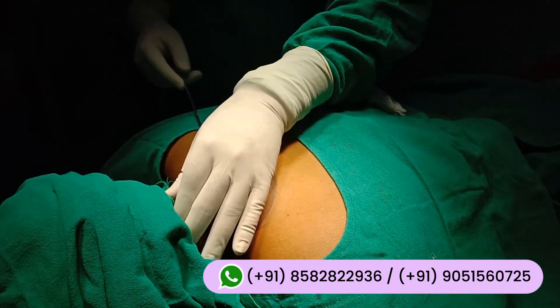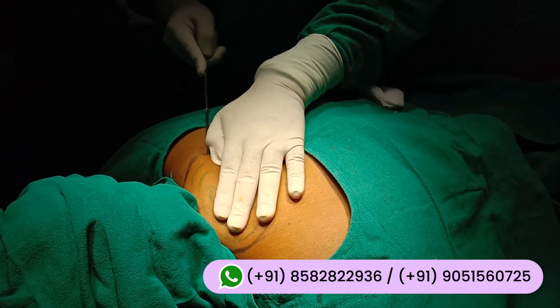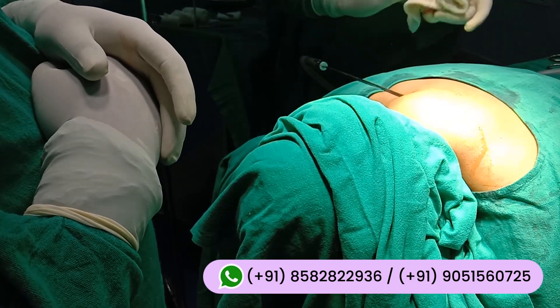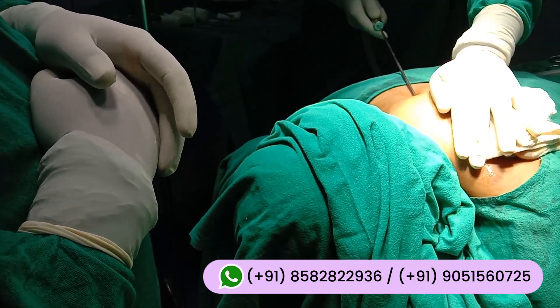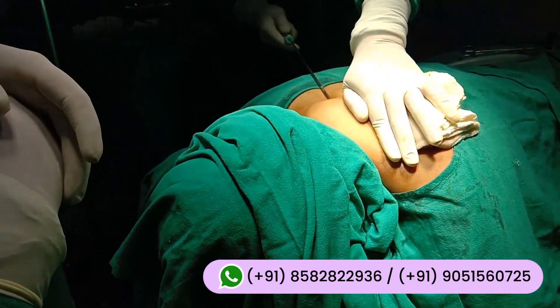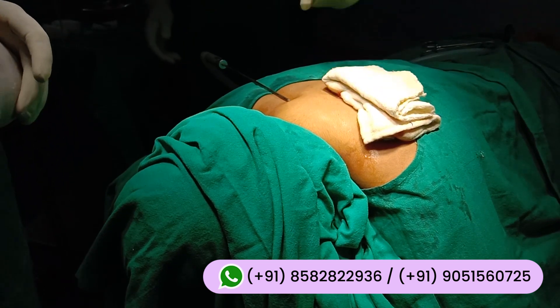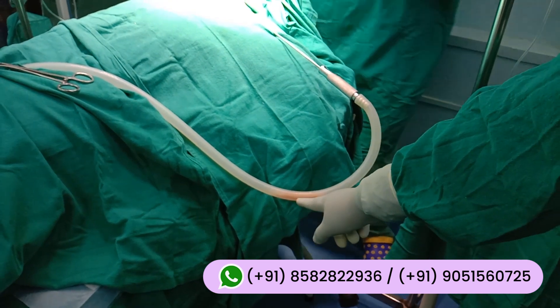And the liposuction. We will do liposuction. Now we are doing liposuction. So you can see this is the fat — this is the fat inside the tube.